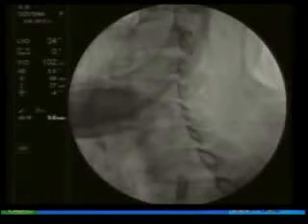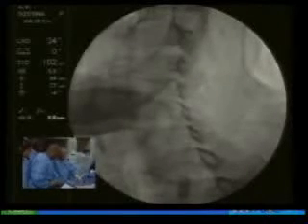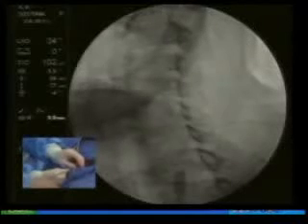Yeah, I'm not getting this. Now you're going to create this AV shunt through the femoral vein, right? It's correct. We have it on active or passive aspiration now, but I think the hypotube. No, I see the balloon up. Stop. When you say passive, Ty, you just mean that the blood pressure is not driving the flow?